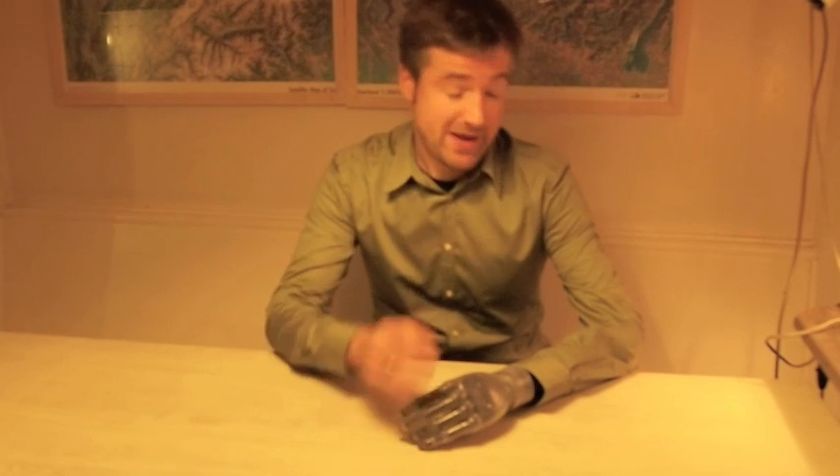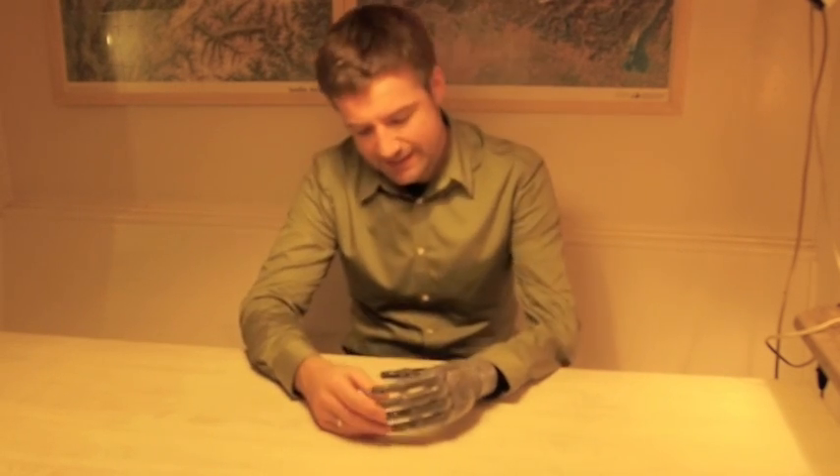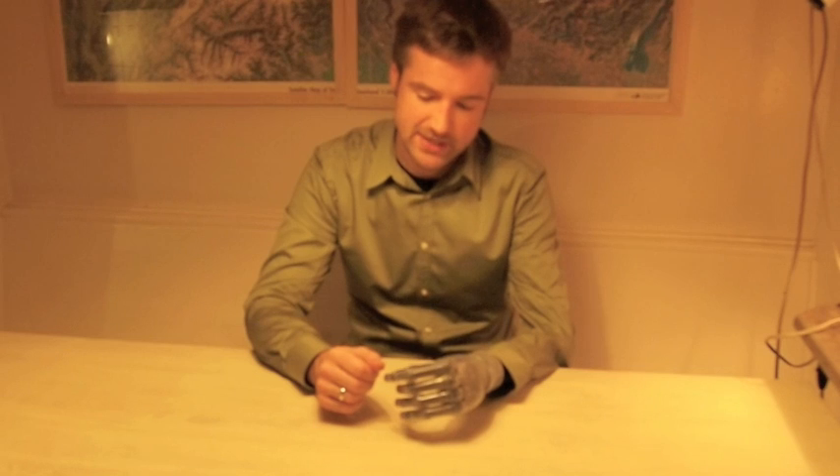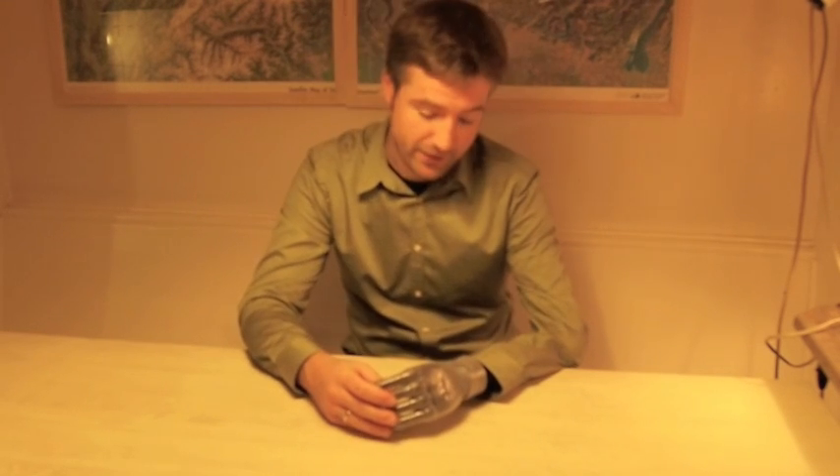Hello, my name is Berthold and I was born without my lower left arm. Very recently, in fact last week, I got this one. This is an i-limb and I'm the first one in Switzerland to get it approved by the public health insurance. So I'm very happy.